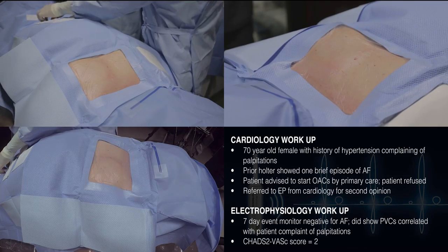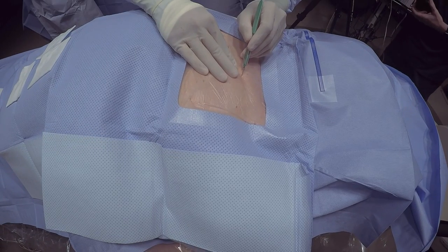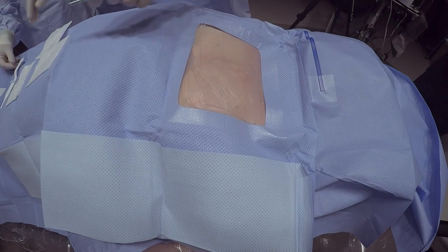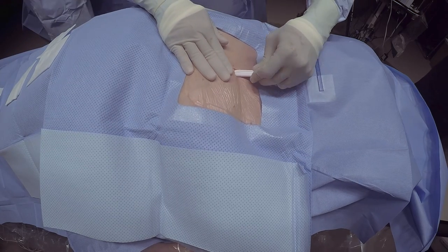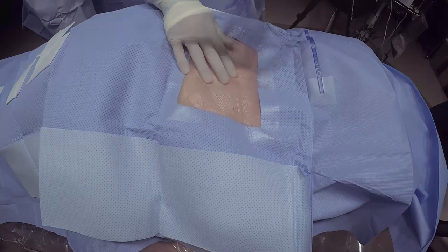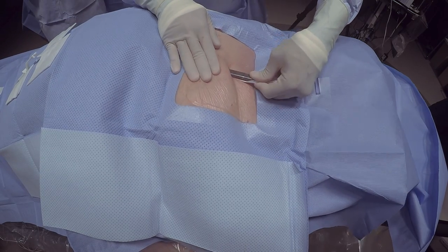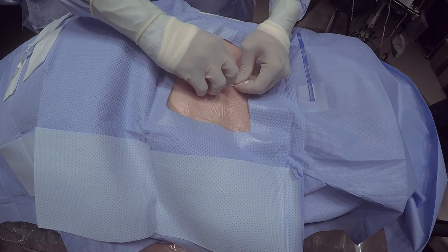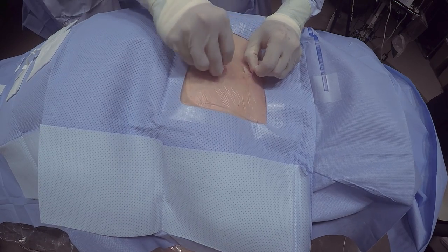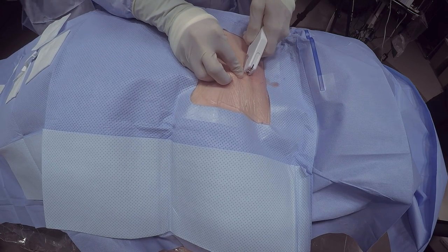I've numbed the skin up, and then I make a quarter to half an inch incision in the left fourth intercostal space, perpendicular to the sternum on the left side. I then use a dilator tool to dilate the pocket and open it up. Following that, I take the loop recorder and injector tool, push the device into the pocket, gently push it in, and once the skin is approximated, I put usually two to three staples on it.